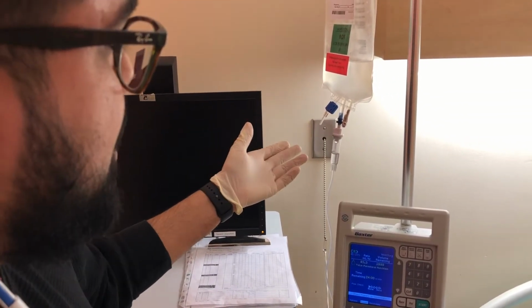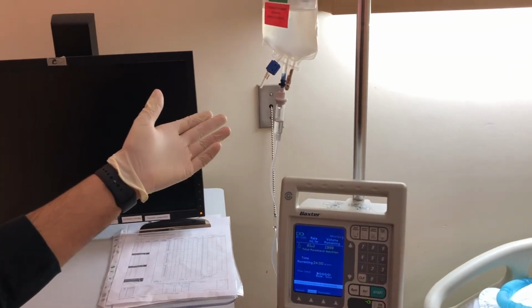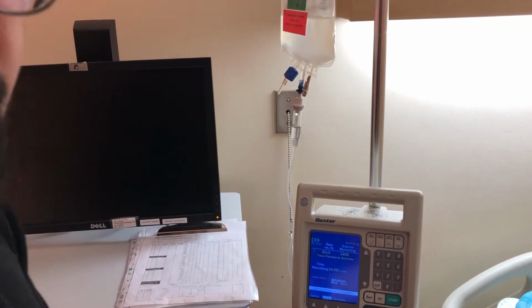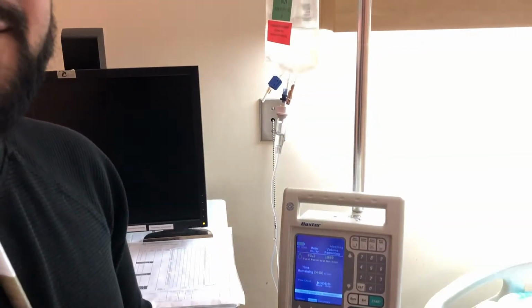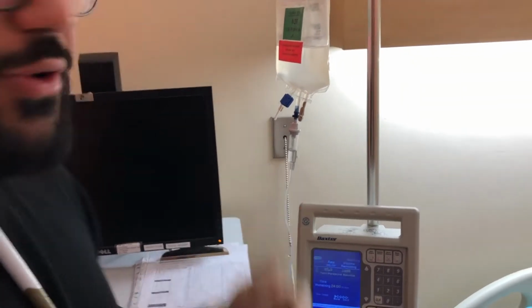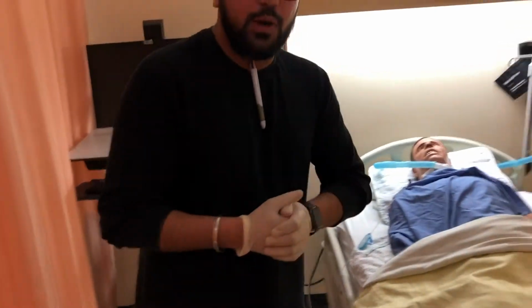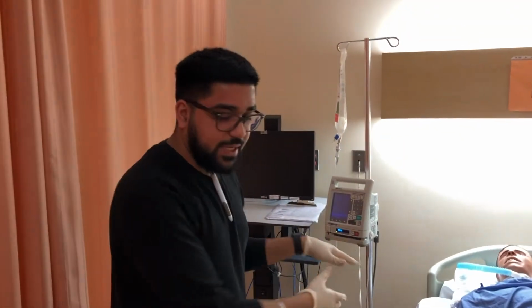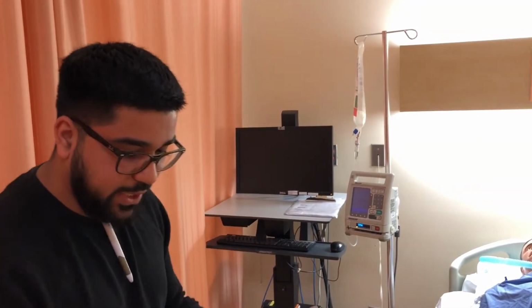And we have the 3 drops going. At this time, I could also tell you guys that the patient did have the right to refuse, but the patient did not refuse, and there are the 3 drops right there. We are also going to document this after and report that we're administering the medication, or the TPN, and it's been done correctly.